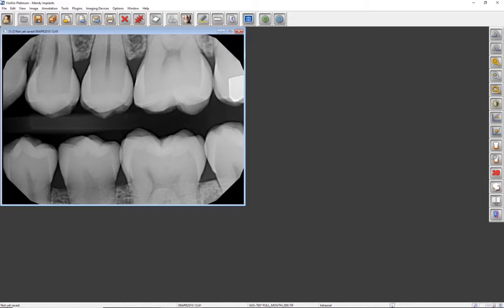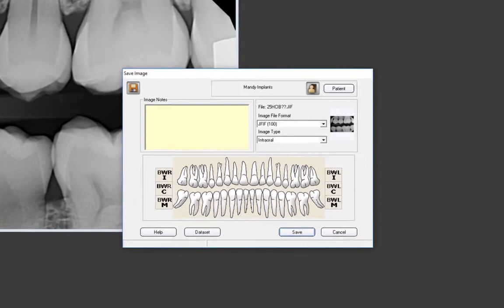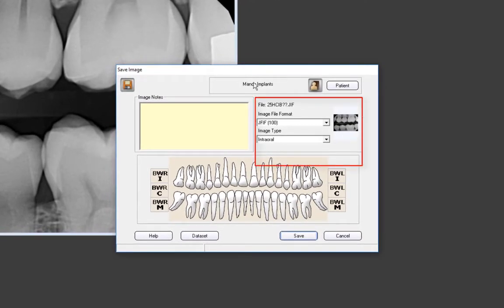While the Windows layout view does not offer the automatic mounting that the full-mouth view does, it will allow the user to assign images to patients. Let's click the Save Image toolbar icon which will open the dialog window. In the drop-downs, you may choose either a TIFF, JPEG, or JFIF file format. If unsure of which to choose, stick with the default formats.